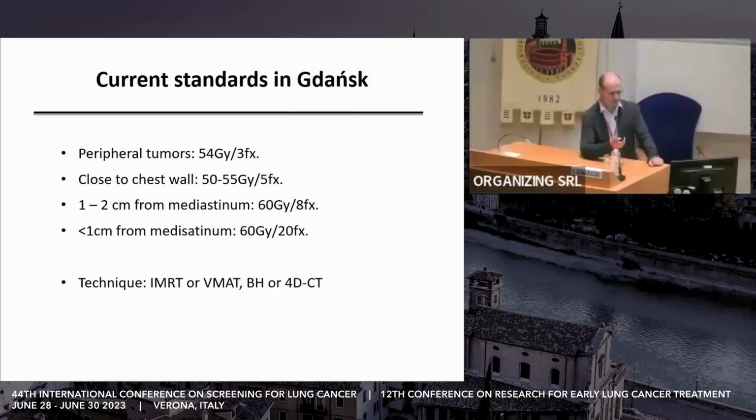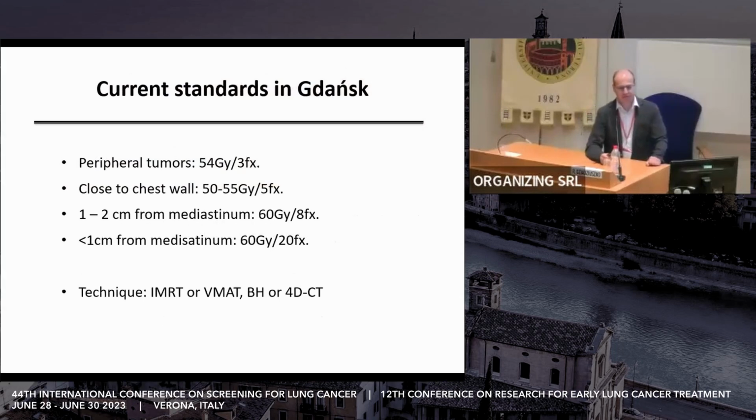We had a wonderful evening yesterday, and it's my pleasure to catch up on radiotherapy advances that we now face, as radiotherapy advances affect very much the patients that are diagnosed with screening detected cancers. So current standards for stereotactic body radiation therapy that we use in Gdańsk were introduced by the colleagues from the Netherlands.